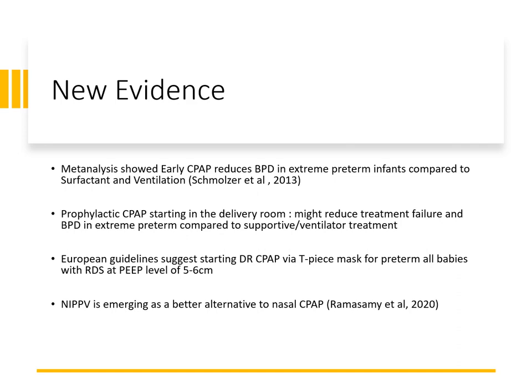Now, there is also something called prophylactic CPAP, that is, starting CPAP very early, immediately after birth, with a face mask using a T-piece in extreme preterm infants. So it has become the standard of care. There might be slight benefit in reduction of BPD in those less than 32 weeks with this approach compared to supportive treatment and later CPAP. However, there is some small risk of apnea when we use a face mask on these infants, and we must keep that in mind.